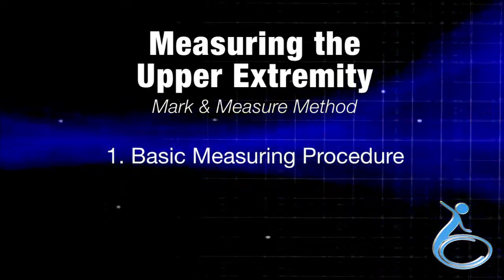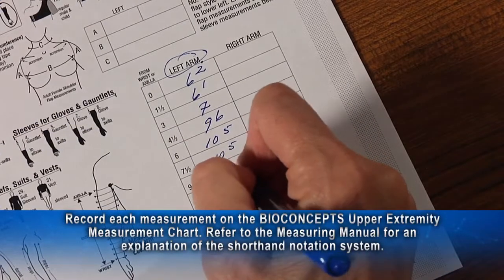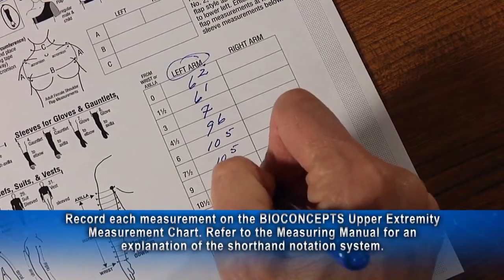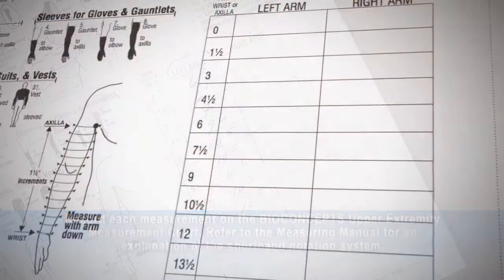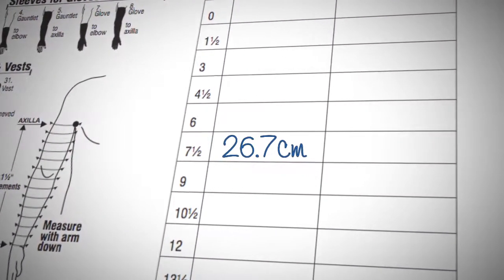Section 1 is the basic measuring procedure. Record each measurement on the BioConcepts upper extremity measurement chart. Refer to the measuring manual for an explanation of the shorthand notation system for measurements recorded in inches. Measurements in centimeters are welcome — simply record in decimal notation.